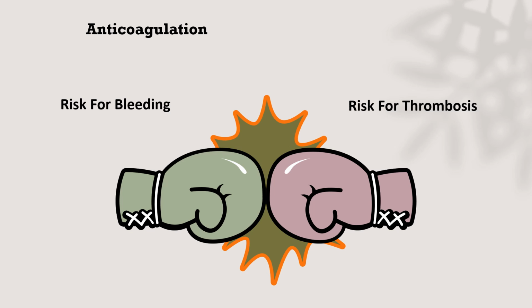And generally, for patients in CCU, we usually use anticoagulation, and these patients usually have MI, having a recent stent. For a patient in CSICU, we don't commonly use anticoagulation, especially if we have full support and full augmentation of the intra-aortic balloon pump. This patient has had recent surgery and may be at high risk of bleeding.